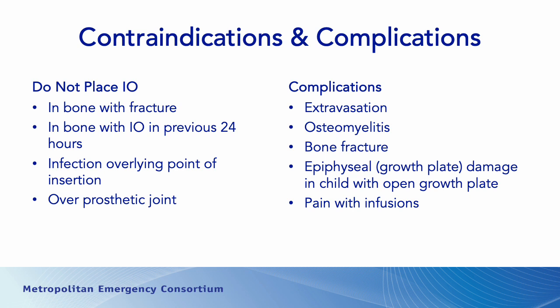If you have a child with an open growth plate or epiphyseal plate, you can damage that if you put the needle in the wrong spot. And if you damage the growth plate, there may be problems with the child's bone growth. And the other potential complication is pain with infusion. So, if you are awake and alert and you have an IO placed, it can hurt to infuse fluids through that IO, which is why as part of our protocol, we have lidocaine available to provide some anesthesia for the patient.